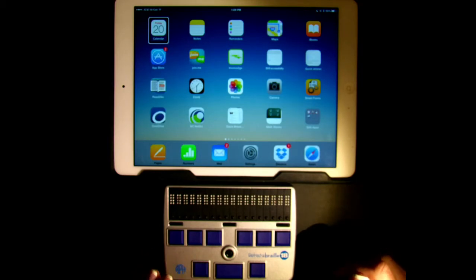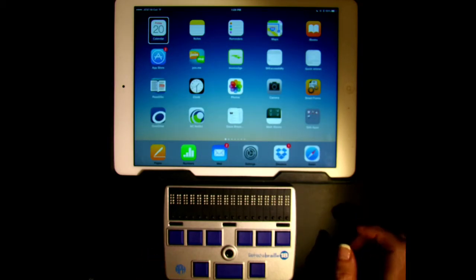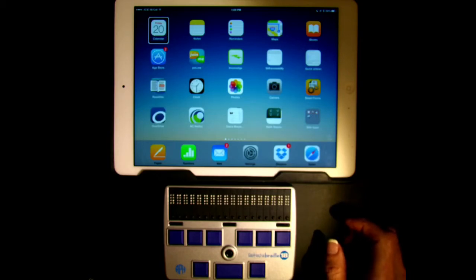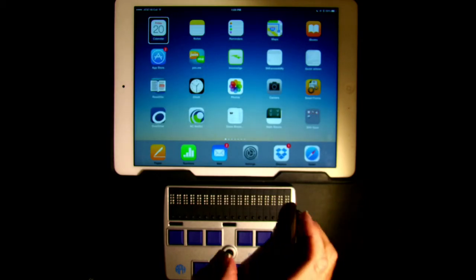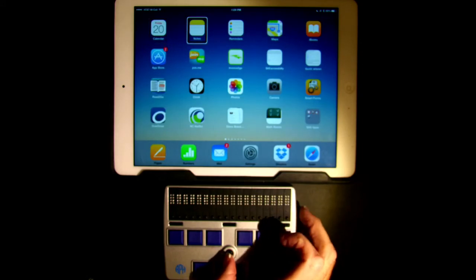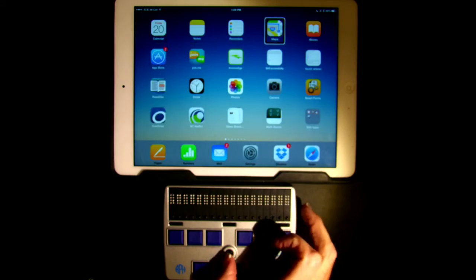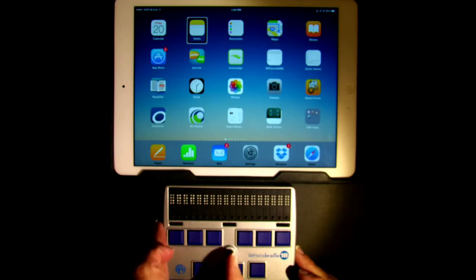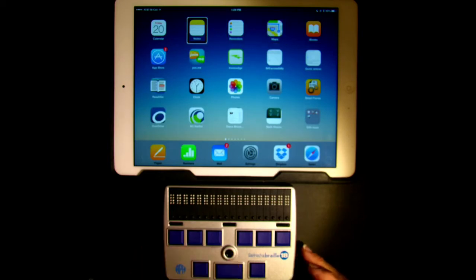We're going to navigate item by item using the joystick flick right or left, or four plus space or one plus space. First I'm going to use the joystick: Notes, Reminders, Maps, Eyebooks — double tap to open. And left to go backwards: Maps, Reminders, Notes — double tap to open.